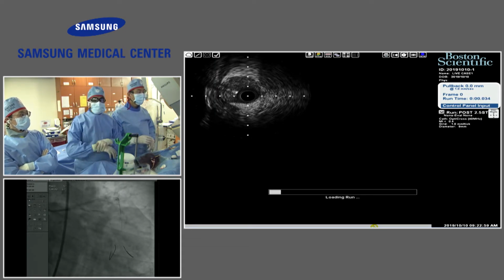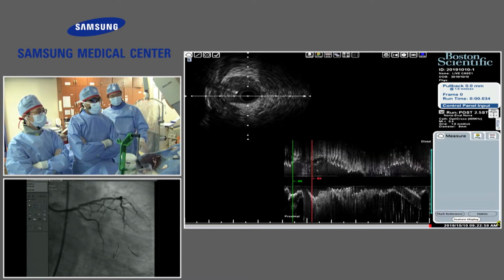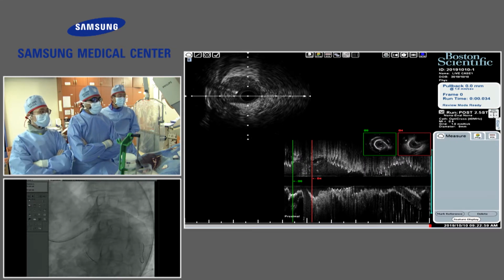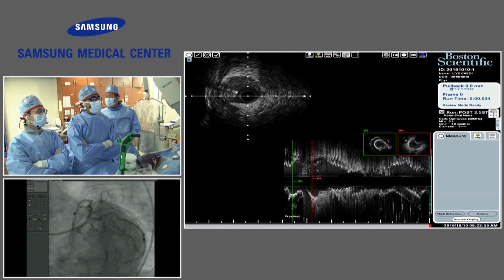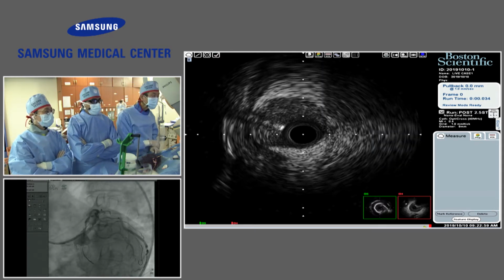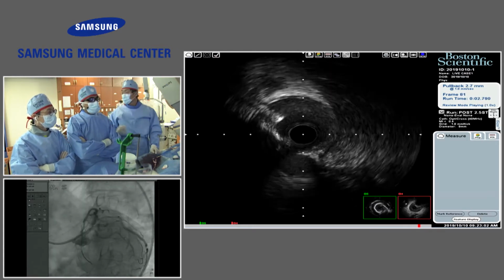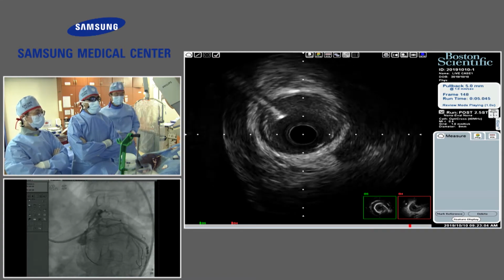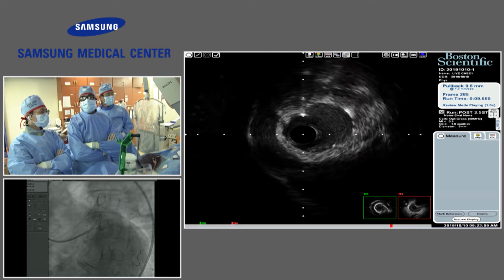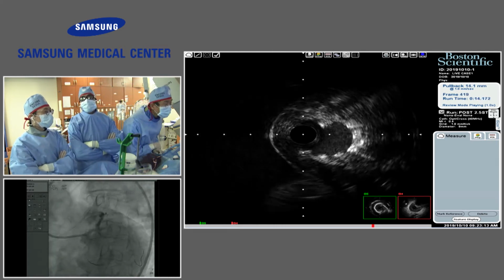So this is what we did in the meantime, guys. We used a Crusade catheter, a dual lumen catheter, on the true lumen wire, and rewired with a workhorse wire into what we thought was the true lumen distal to the dissection. And then we re-IVUSed, which you're going to see now, on the Crusade wire that entered into the distal OM branch. And that's what ensured for us that we were actually in the true lumen. So start this IVUS run distally, please.